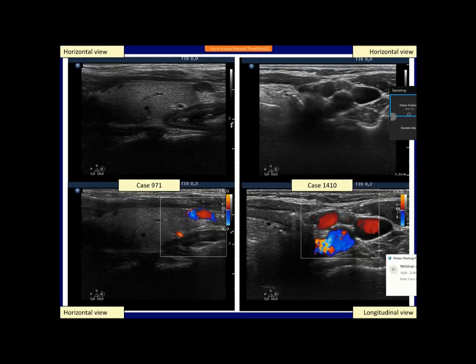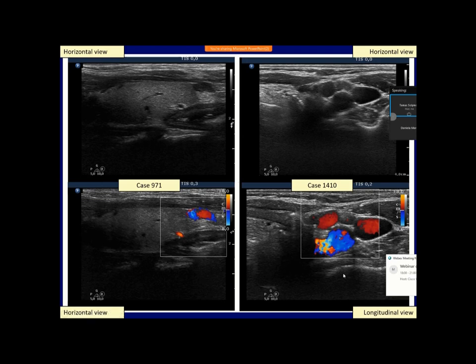However, as a by-product, all experienced ultrasonographers use Doppler mode in everyday practice. I present some possible applications. First, two quite simple examples. There is a deeply hypoechoic or anechoic lesion in the lower part of the thyroid lobe. On grayscale mode, color Doppler mode disclosed that this is not a cystic lesion but a vessel. The right patient was operated on for thyroid cancer and presented with multiple hypoechoic lesions in the left thyroid bed. The ventral, more hypoechoic lesion proved to be not a vessel but a reactive lymph node. We choose the Doppler mode and can reveal which hypoechoic lesions are vessels and which are not.